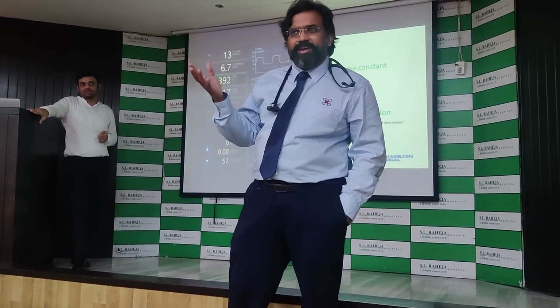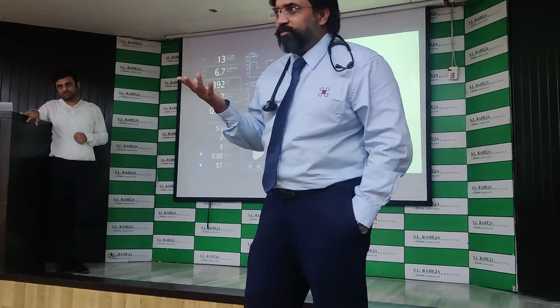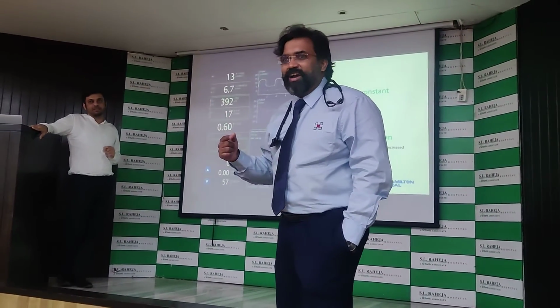You understand? The time constant is 0.1 to 0.2 seconds. I don't require more than that to inflate and deflate my lung to 63%. But I don't want 63%. How much do I want? 97%. I want 90 plus percent.